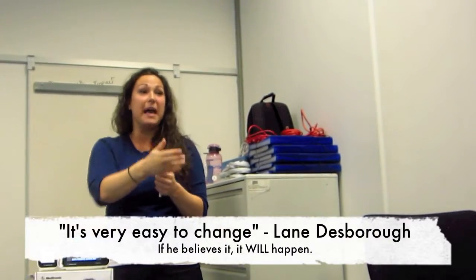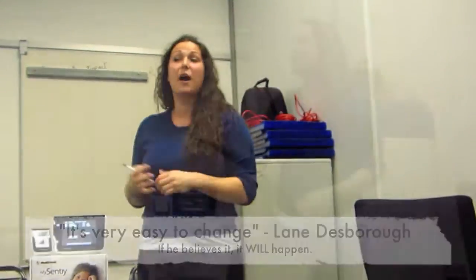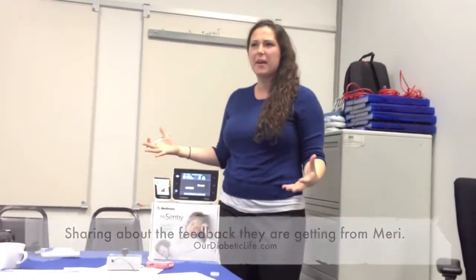Do you think that'll change? Yes. I think that's something that's very easy to change, and I think Lane will probably speak a lot about this in his talk. Where we think about that, and whenever we hear feedback from her on what she's thinking about the product, and giving us that real feedback so we can then incorporate that for the future.